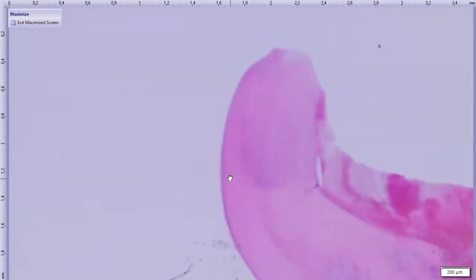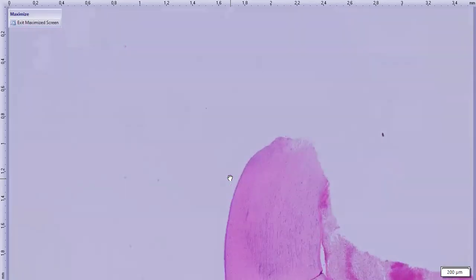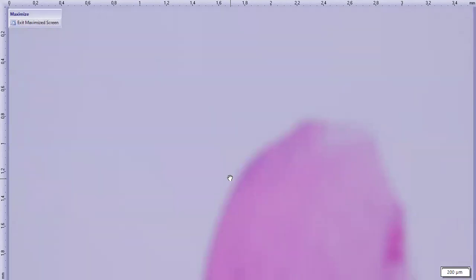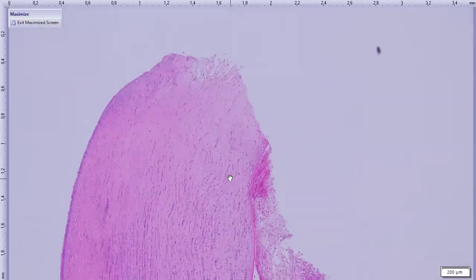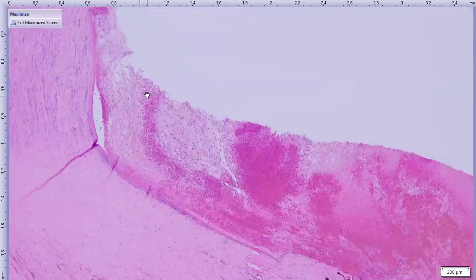So as I said, we didn't actually sample the corneal defect, but here on one edge, we can see that here's Descemet's, here's this corneal surface, and we have the epithelium sort of growing down at a bit of an angle to the corneal stromal fibers. And that is an indication that this is an area of stromal loss with some at least vague attempts at reepithelialization. So as I said, I didn't actually get to sample the corneal defect in the deeper section either.